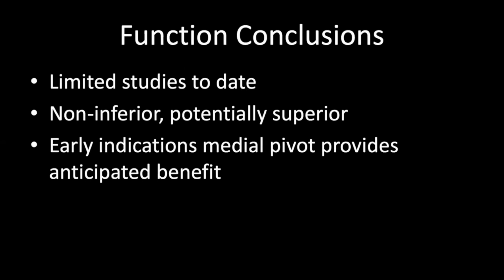When we look at function, there are currently only limited studies to date, but we see that the medial pivot knee is non-inferior and potentially superior in function in comparison to traditional total knee arthroplasty. Early results indicate that the medial pivot knee provides anticipated benefit as expected.